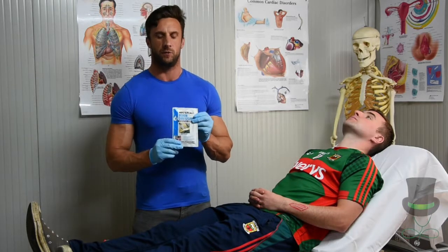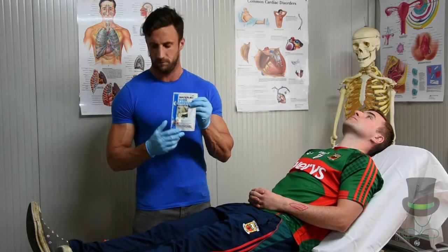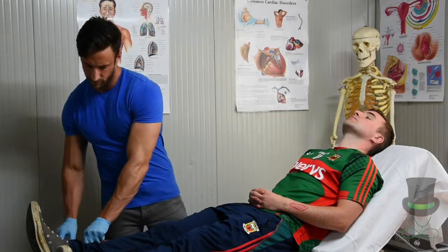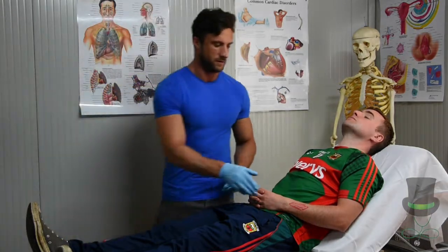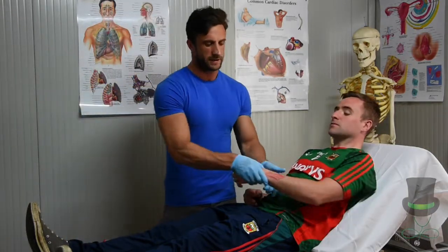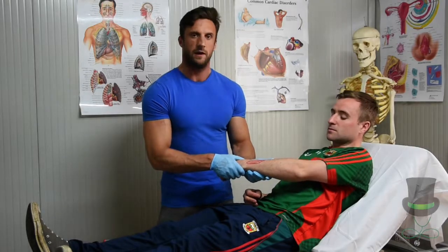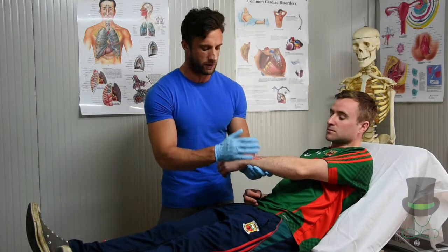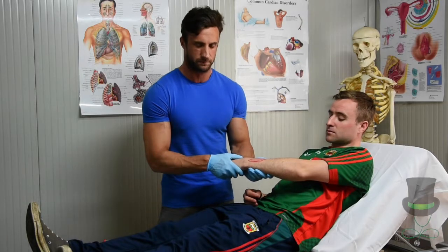For this demonstration we're going to use the water gel burns dressing. Expose and examine the site of the wound, irrigate the wound and brush off any chemical powder or debris on the site of the wound.